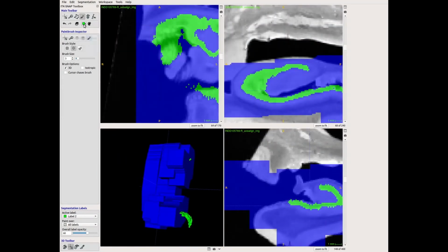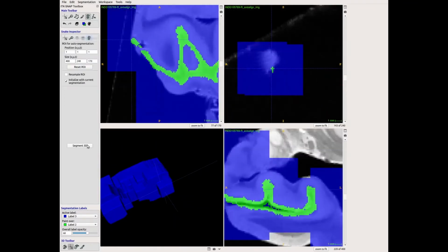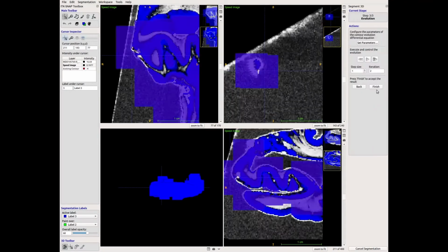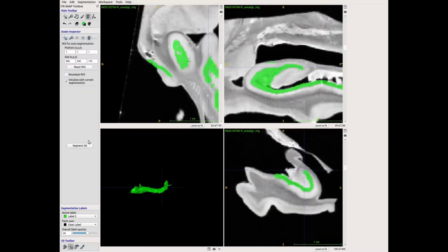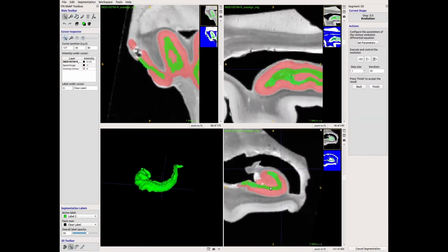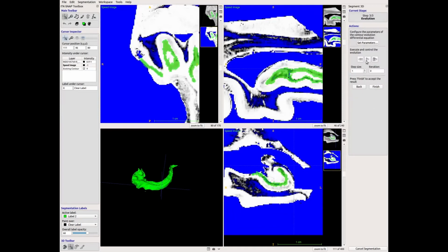Below the hippocampus, we have the white matter of the temporal horn, and then on the medial side, we have the ventricles, and then immediately under that, we'll have thalamus. It's not in this image, but you'll also see choroid plexus above the hippocampus. And so all of these labels can be easily confused with hippocampus, and they have similar intensities to the dark band especially. And so we really need a really tight spatial prior to know where that is.